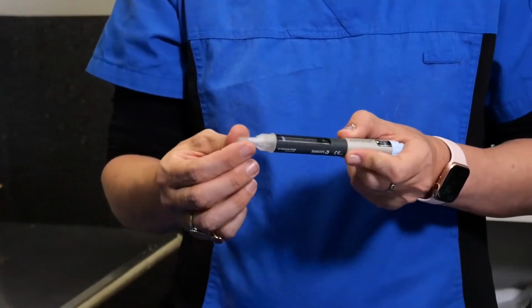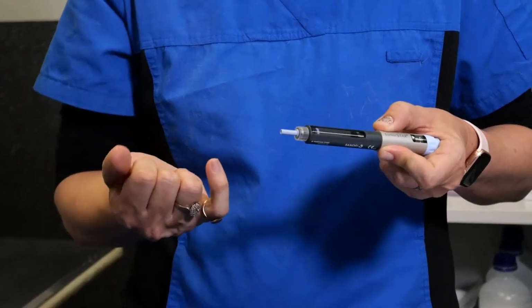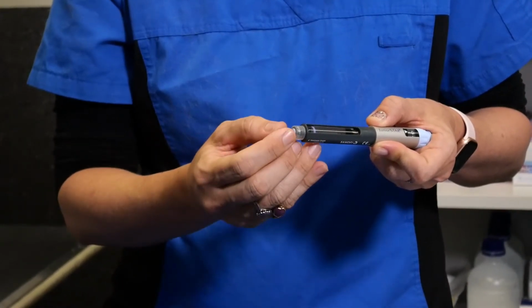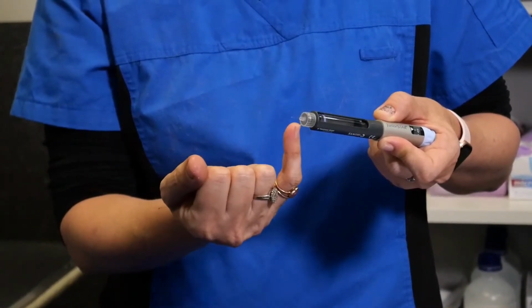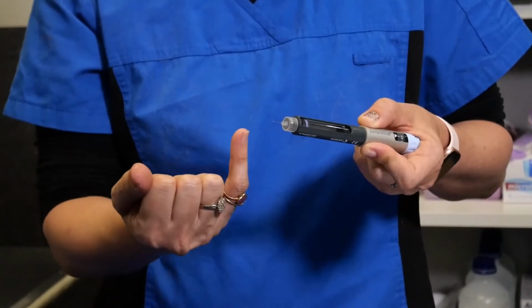Next, what we do is remove the plastic cap. It's also important to note that there's another protective cover here on the needle, so this also needs to be removed. Then this is the sterile portion of the needle that you'll be using to inject under the skin.